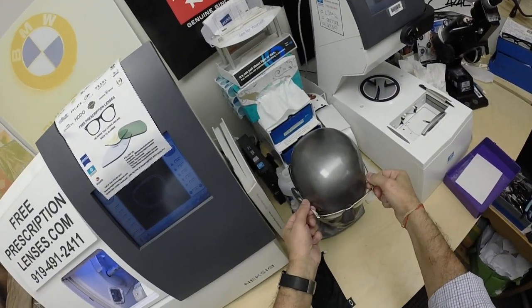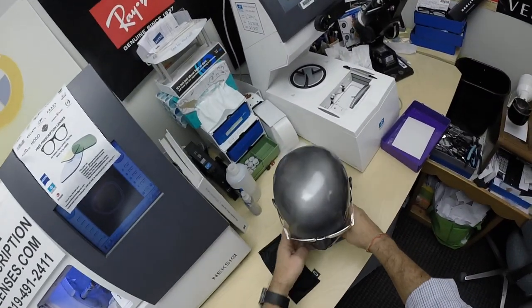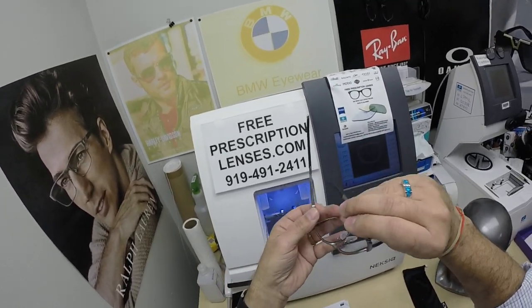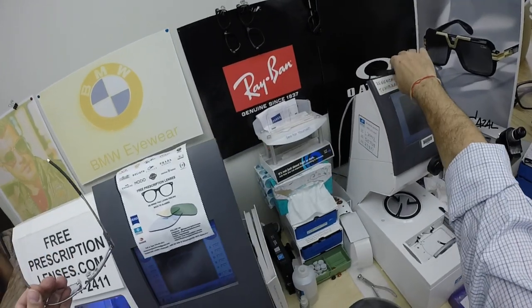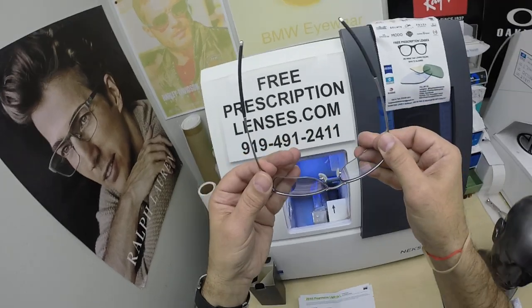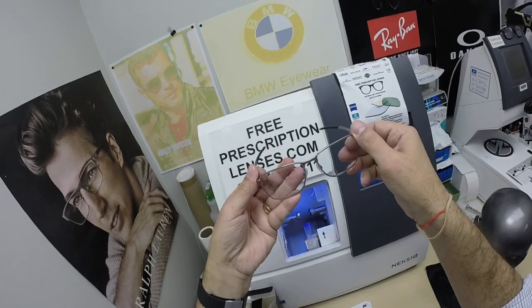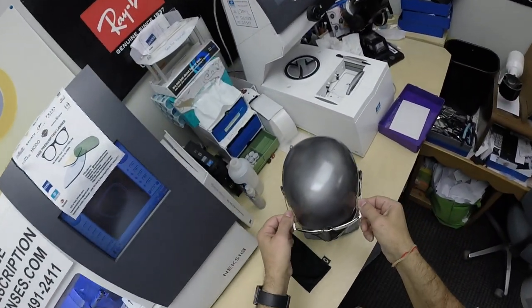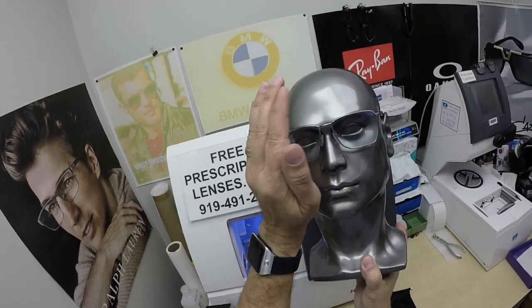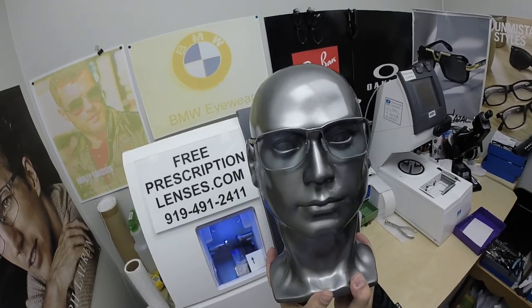This is what they look like clear. Now this is a really cool frame — classic thin styling. It has some built-in wrap to it; it's a five base frame. Most frames are four base, a little bit flatter. So it gives you the appearance of wrap without the distortion that some high wrap frames can cause. That's why most eyeglass frames are four to five base. When I say base, that refers to the curvature.